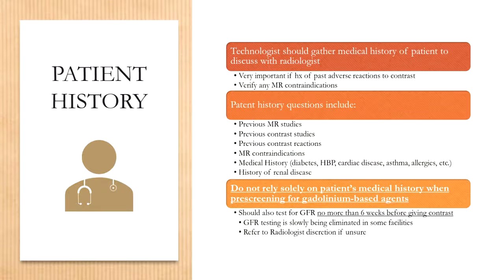All right, so we've talked about the types of contrast agents that we'll use, and we've talked about how they affect the magnetic field, which in turn affects the molecular tumbling rate, and that's how these gadolinium or contrast agents will influence our images.